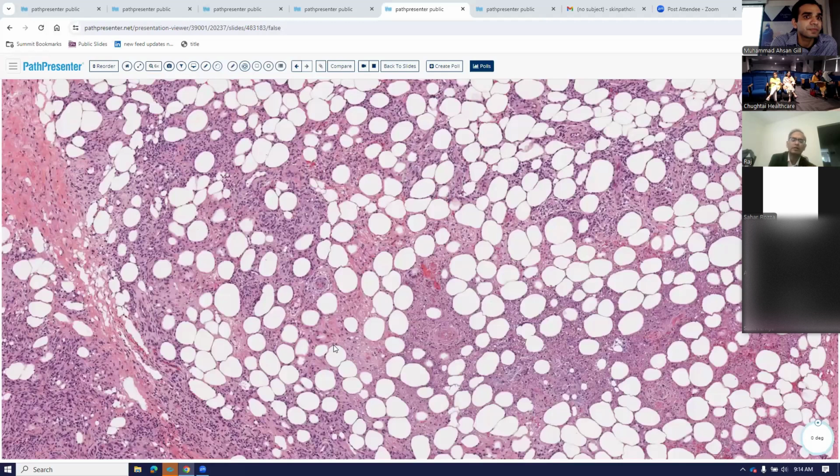People tend to let go if they do not see the neutrophils, or if they do not see the fibrinoid degeneration. But if you are going to follow textbook rules, then you definitely want to see the fibrinoid degeneration on the vessel wall to call it vasculitis. You always have to be a little bit wary about the clinical picture. But yes, the textbook definition for vasculitis in the skin depends on the fibrinoid degeneration, not on the presence of the neutrophils. You have to have the neutrophils, obviously, but without the fibrinoid degeneration, a textbook doesn't call it vasculitis. It is not equivalent to vasculitis.